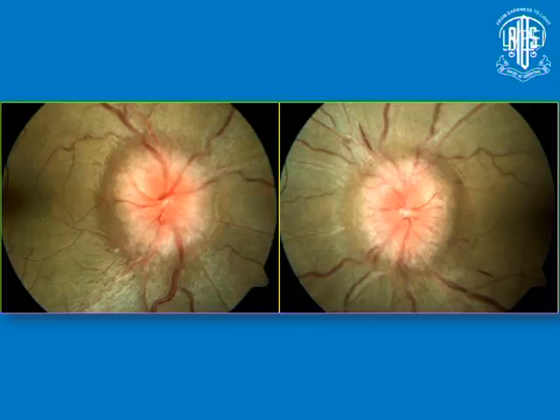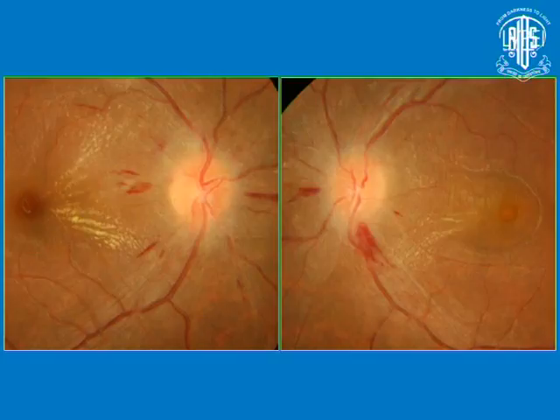These are again because of the vascular signs, because of raised intracranial pressure. Another example: both discs are swollen because there is edema of the nerve fiber layer, the disc margin is blurred, and you again see vascular signs like hemorrhages, exudates and leakage from the disc. These are all signs of true disc edema.